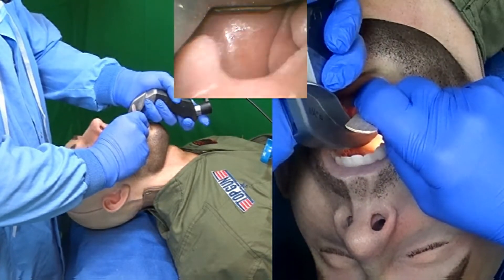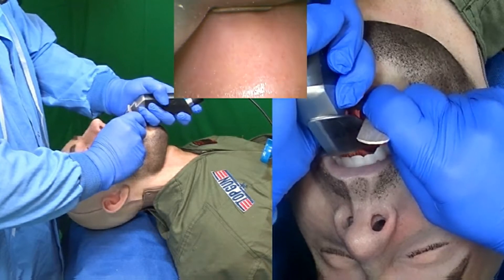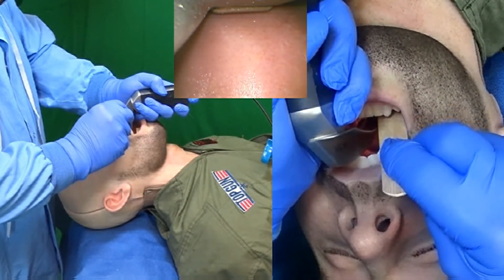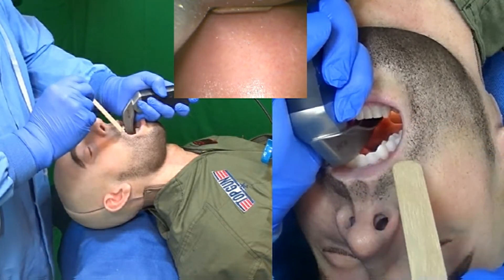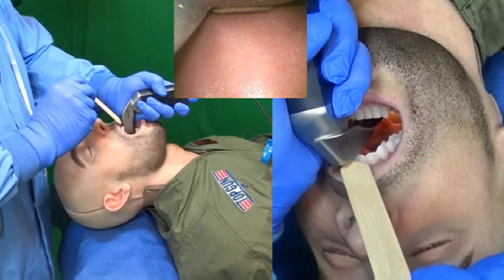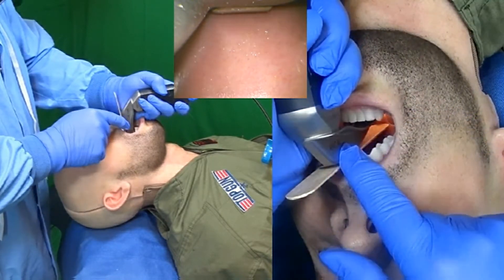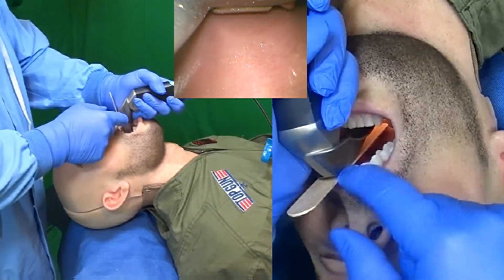I'll place the laryngoscope straight over the top of this tongue depressor, and as its usefulness becomes limited, I'll remove it from the mouth. If I'm concerned about the patient's upper teeth, I can take that tongue depressor and put it between the laryngoscope and the top of the back strap of the blade.